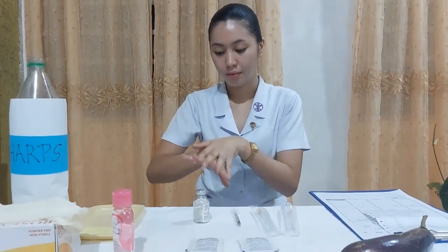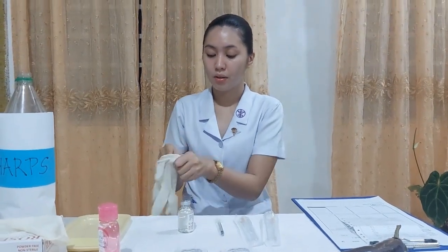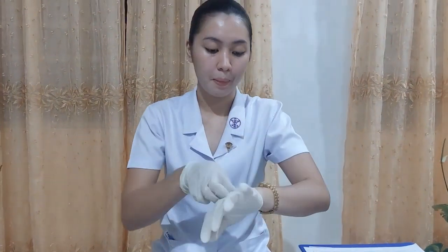Of course, I'm going to be doing hand hygiene. And I'm also going to don my gloves. This is for infection prevention, of course. Now that I have put on my gloves, before we open the container of our medication, we're going to be mixing the solution inside of it.